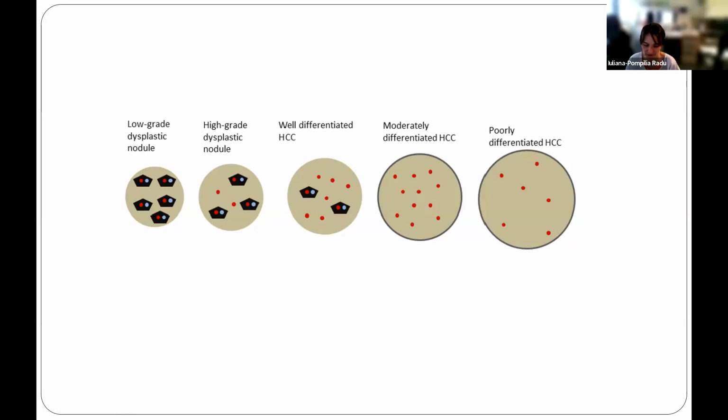So an ultrasound examination with contrast has to be performed correctly until 5 minutes. Because if it's a hepatocellular carcinoma and you stop at 3 minutes and say, oh, it didn't have any washout, then you might miss a hepatocellular carcinoma.